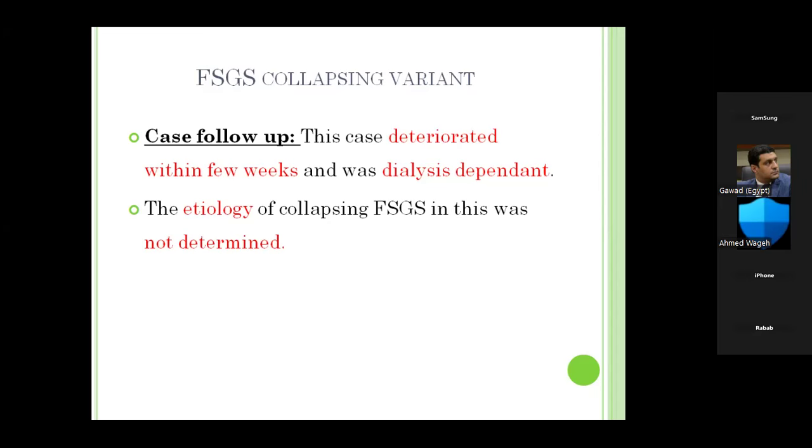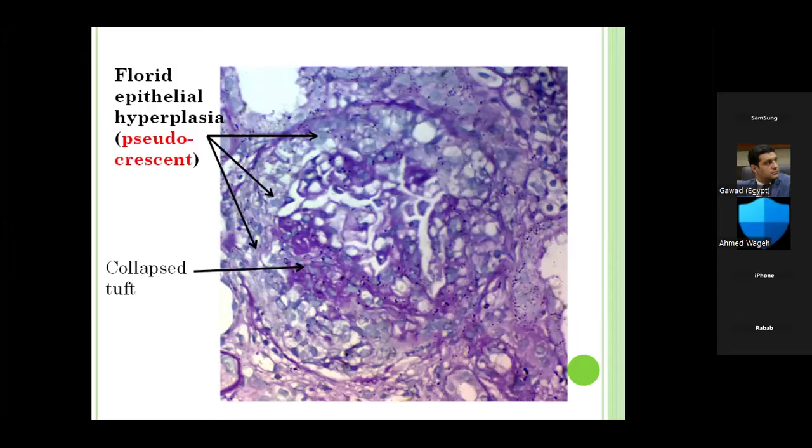Morphologically, the main difference between pseudocrescent and a true crescent is the presence of other components. What are other components? The inflammatory cells, the fibrin deposits or the fibrin component in the crescent for the true crescent, but in the pseudocrescent, only one type of cells, one type of nuclei. If we can see here, all of these nuclei are the same, similar, no difference.